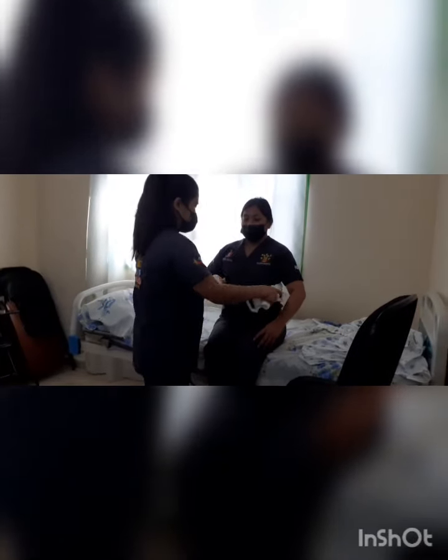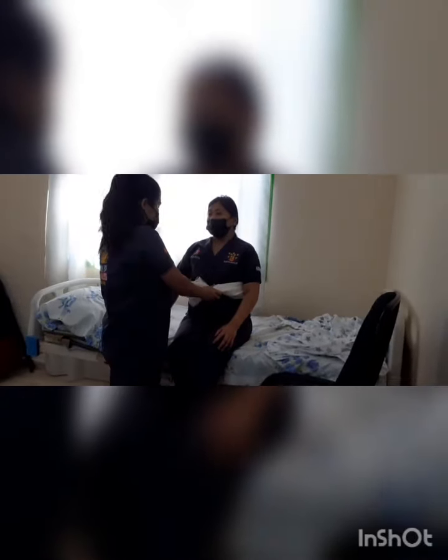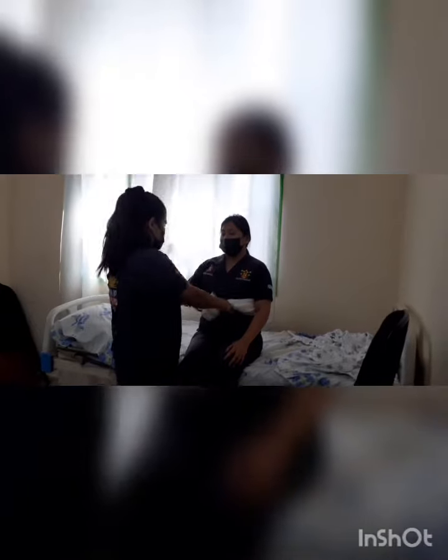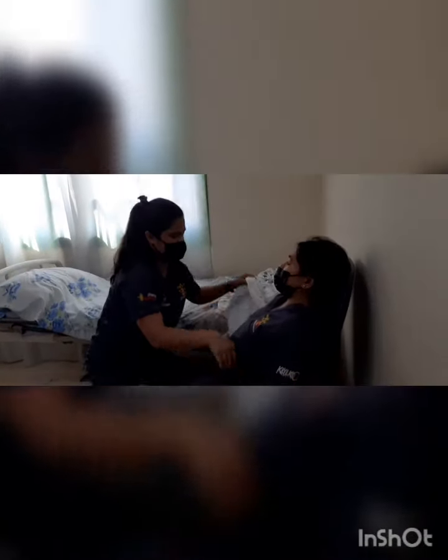Okay Mrs. Ray, the side of the bed — you can open it. I will let you out. Okay, one, two, three. You have to fasten the safety belt, okay? You have to use the seatbelt. You can press the belt buckle. I can use this handle to walk you in the wheelchair. Mrs. Ray, I will transfer you in the wheelchair — you can open the side, okay? You go this side. One, two, three. Okay, let's wait. Good.